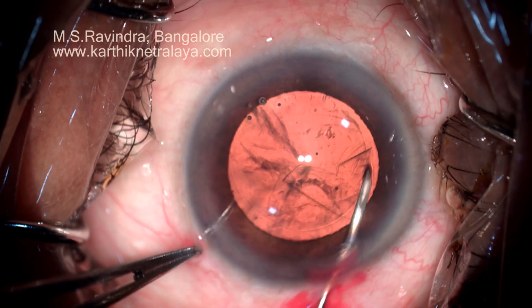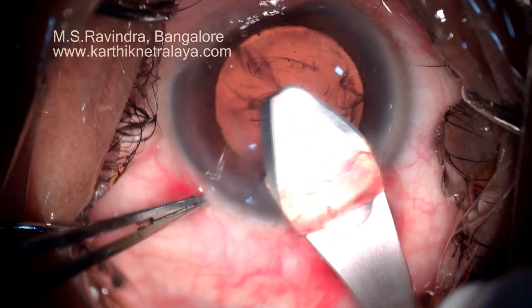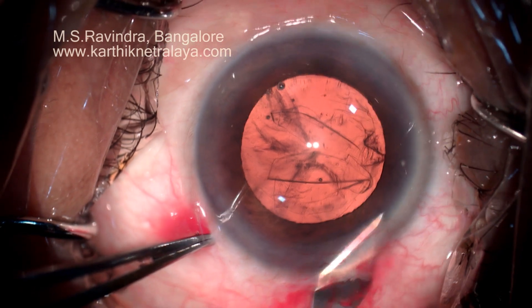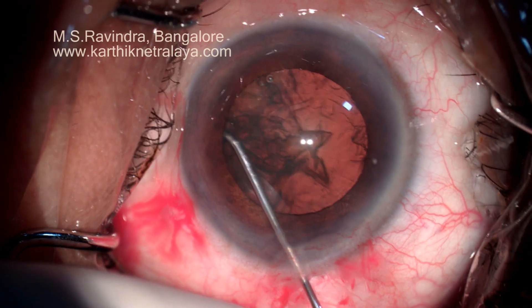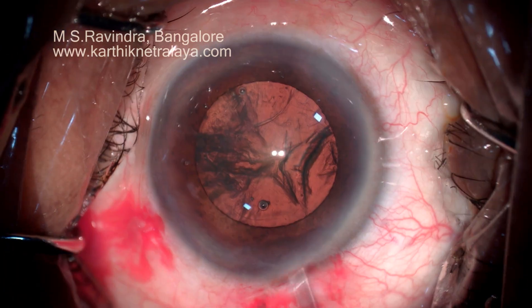See that the cystotome is not passing through the tunnel — it enters the floor of the tunnel at the limbus and gets into the anterior chamber. This is a trapezoid tunnel; the anterior end of the tunnel is slightly widened to minimize corneal damage when the nucleus is being taken out.